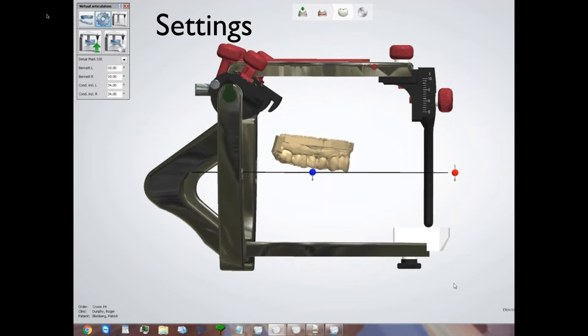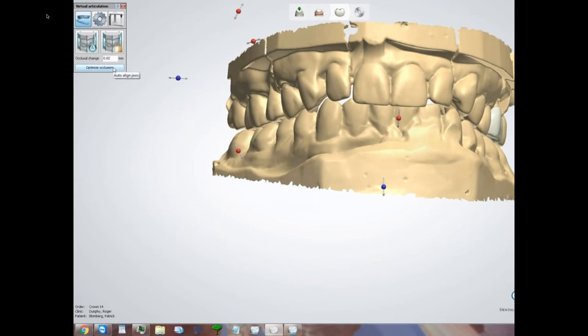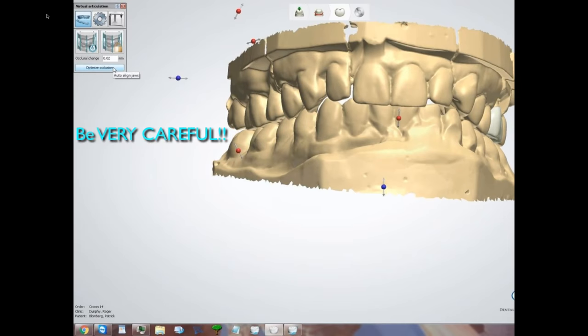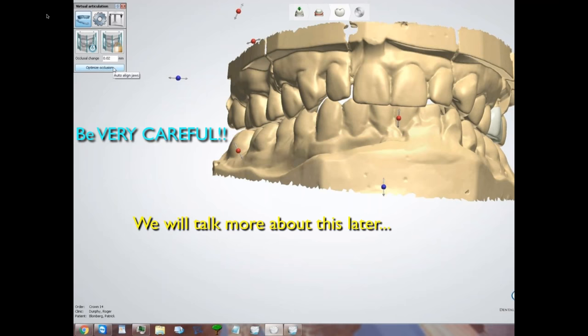Like everybody else, I muddled through this and figured out a little bit of what's going on. I just want to go over some of the settings in the VA — virtual articulation — to make sure we're all clear on what they do. When we first start the virtual articulator, we see this screen with a button at the bottom called Optimize Occlusion. It does try to reorient the jaws into a position of maximum intercuspation, but it can be very dangerous.